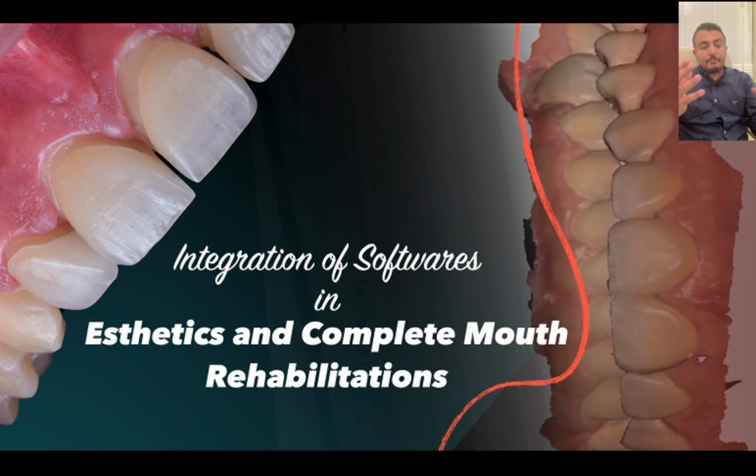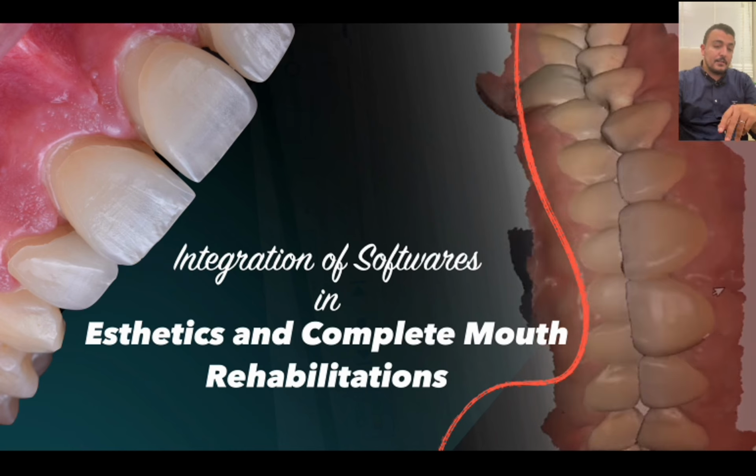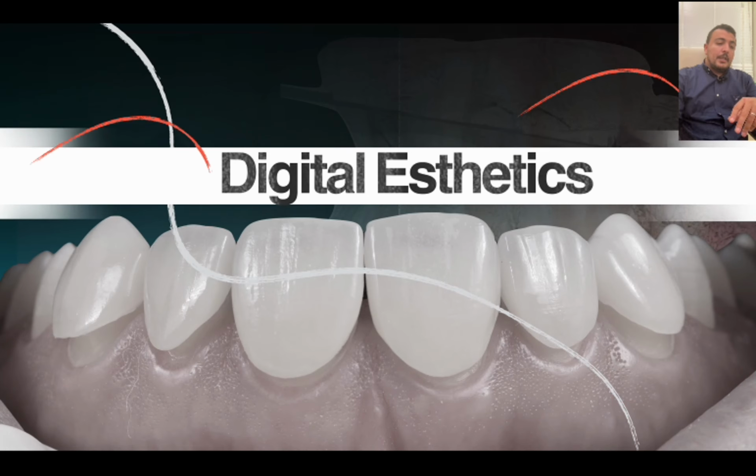So today I will try to discuss how to integrate the software, especially Medit software, to enhance the ideal occlusion outcome for aesthetic and complete mouth rehabilitation cases. And because usually our role as prosthodontists in digital aesthetics especially is to restore the ideal function and the aesthetics and also the occlusion.